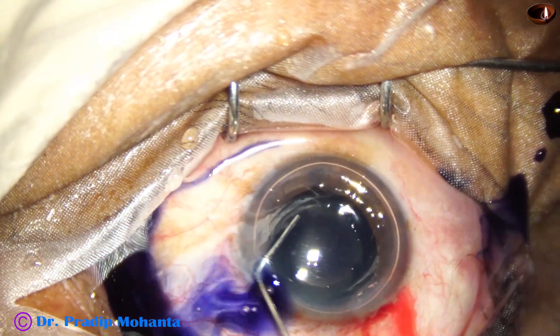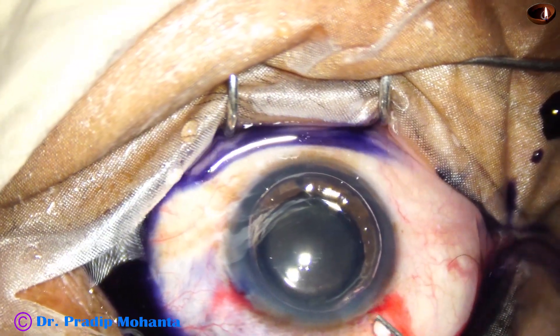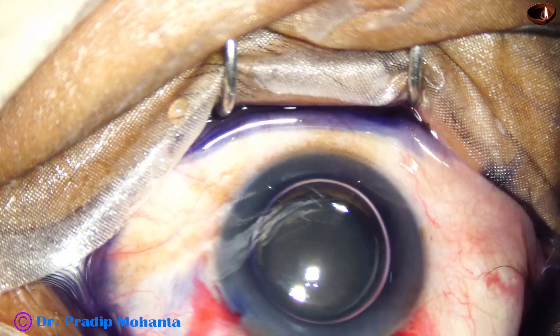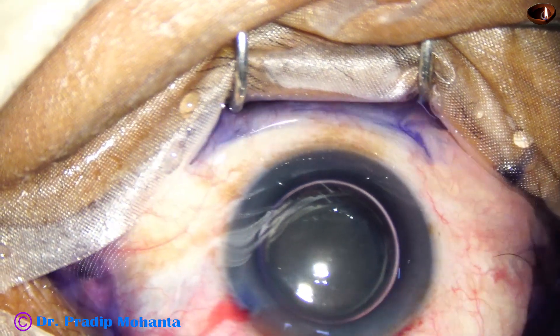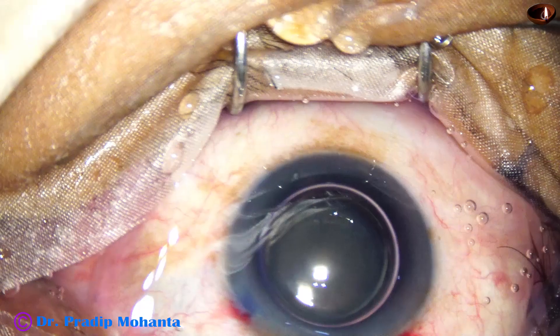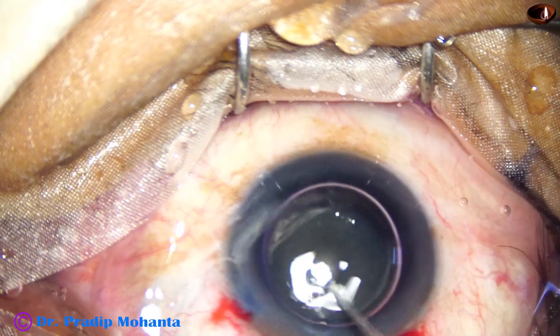Adrenaline is added, and now excess dye is washed out. This is an attempt to prevent TASS — toxic anterior segment syndrome. Moreover, if the dye is not washed out, there is more concentration of dye at one part of the anterior segment.